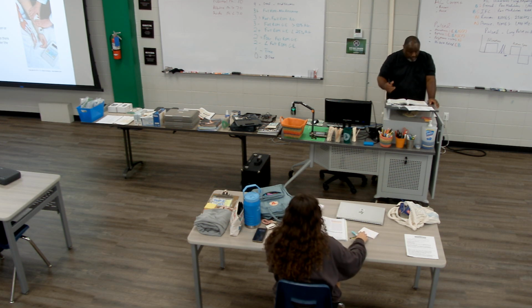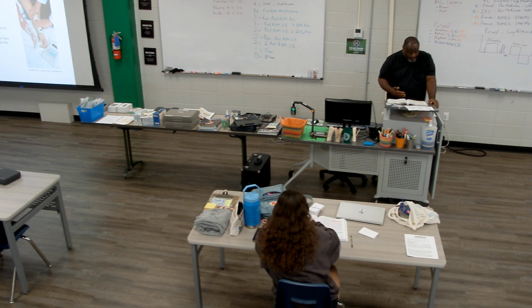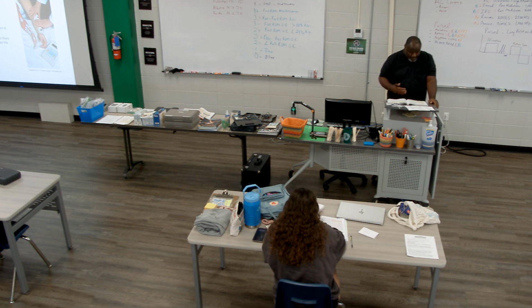Skip down to that paragraph underneath that, kind of the middle. There's a couple of lines here that are very important. It says the opening of the pores during iontophoresis is time dependent. That's important to know, as is the closing following the iontophoretic process.